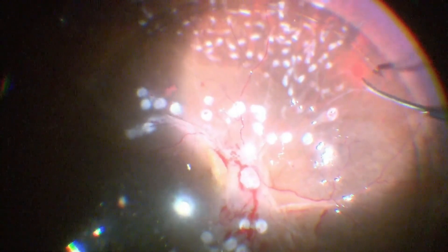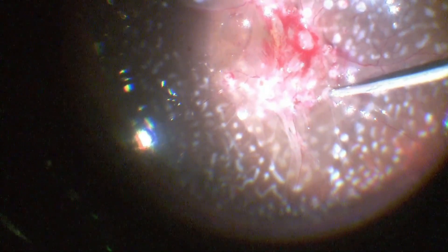Endo laser was done 360 degrees in the periphery. Fluid-air exchange was carried out whilst aspirating PFCL. Silicone oil was injected to maintain better stability of the retina postoperatively.